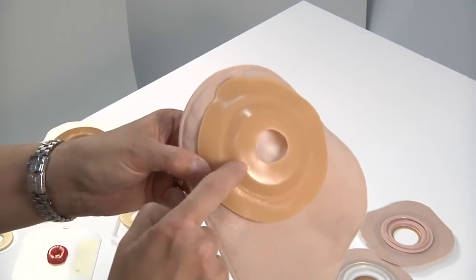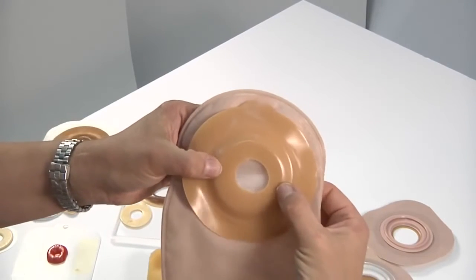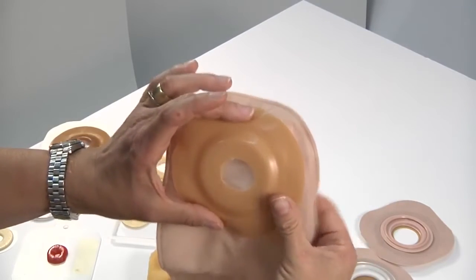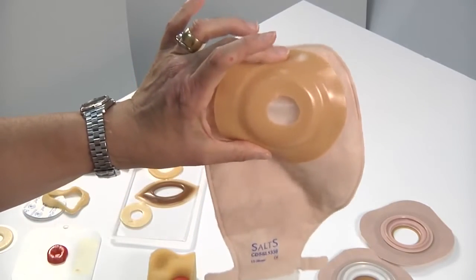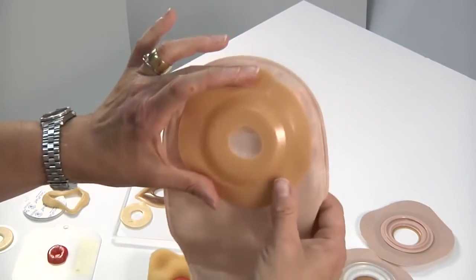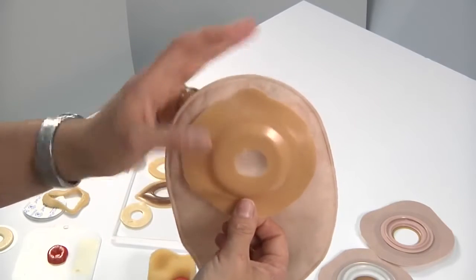Almost, you can sort of see where the plateau starts. So your tension is way out here. Okay, so this would be for somebody who has, again, a very minor dip or gully that you're trying to fill in, or has a small fold that you're wanting to hold open.